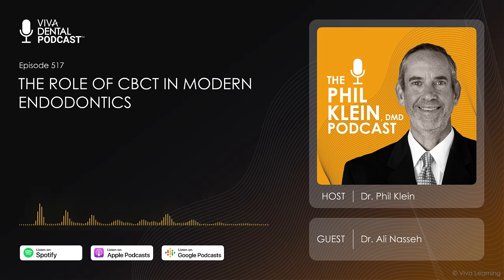It seems to me as an endodontist that CBCT, with all this information you just described, will remove most of the surprises. Often when you start a case, it looks pretty basic and routine, and then you get surprised once you get in there. That changes the whole sentiment of doing that case, and it can be a little bit stressful, especially while the rubber dam is on and you've got 2 patients in the waiting room. So having that information ahead of time and planning ahead, like you described, would eliminate a lot of the unpleasant surprises that endodontists and general dentists who do endo face.